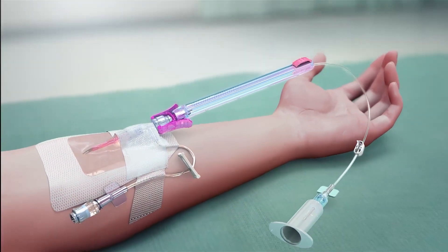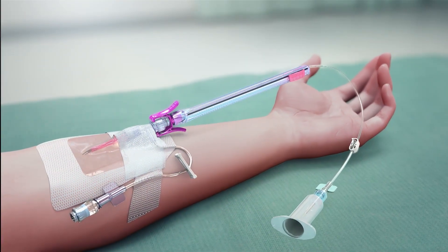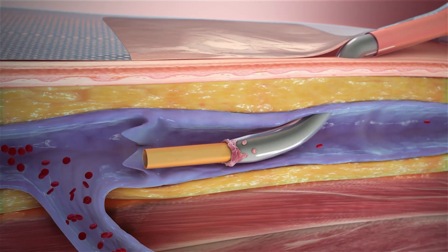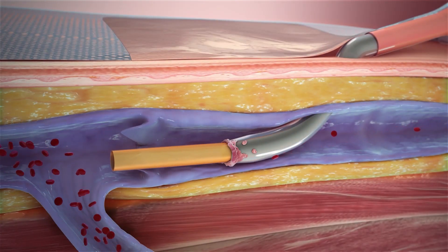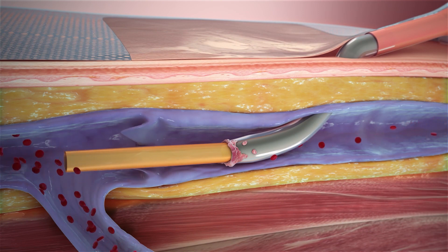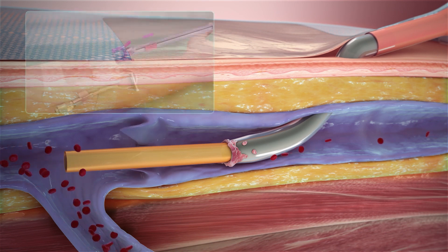After connection to the peripheral IV catheter, moving the PIVO device slider forward advances an internal flexible flow tube through the catheter and into the vessel, moving past the often suboptimal draw conditions around the catheter to reach vessel locations where blood flow is optimal for aspiration.